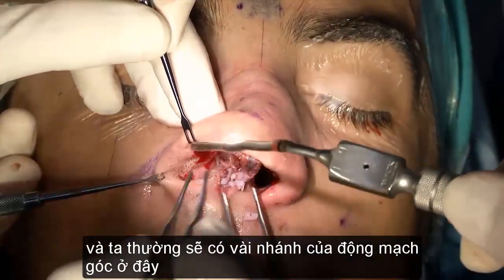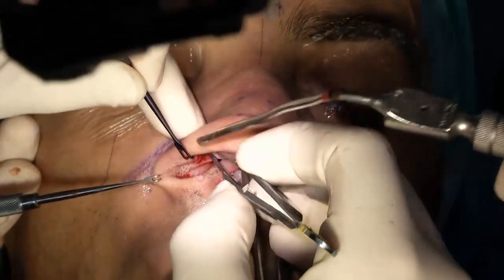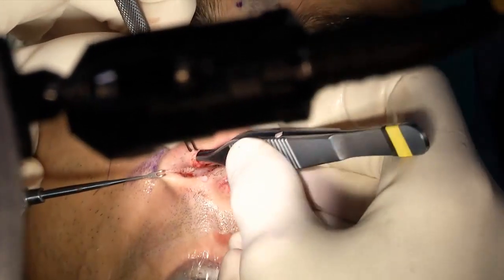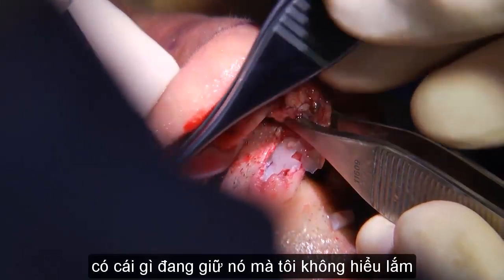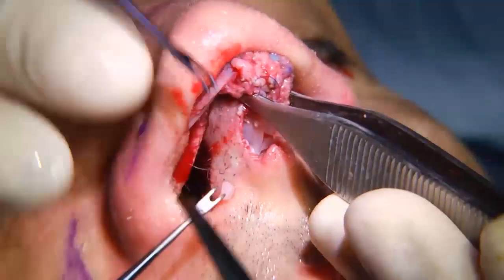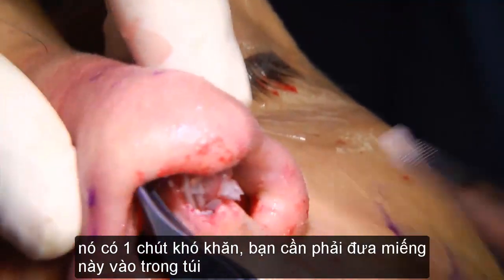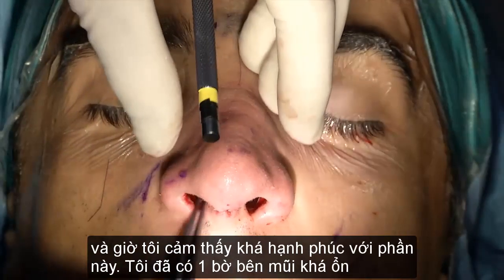Something is holding it, which I don't understand. There we go. So now, it's a little bit tricky. You need to get this thing really in its pocket. So I'm pretty happy with this. I got a good sidewall.